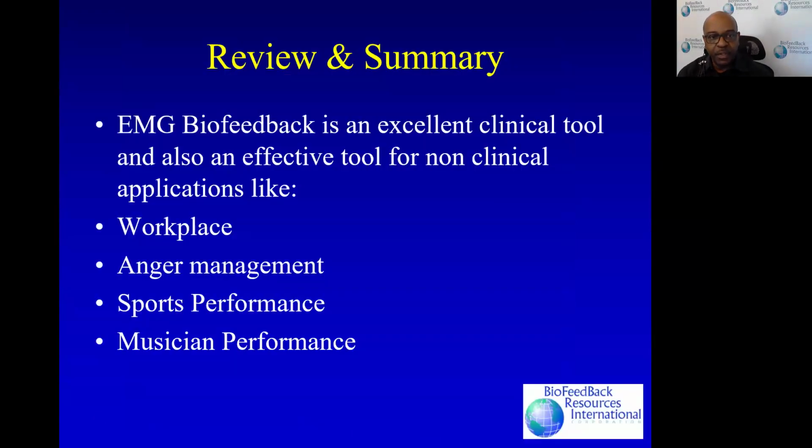And then just to review, EMG biofeedback is a great tool that you can use clinically, and you can also use it for non-clinical applications. We talked about the workplace, thinking about at the computer, anger management, sports performance. With sports, you can look at how a person is using their muscles. Are they contracting the muscles that they should be contracting? Are they keeping the other muscles that don't need to be contracted relaxed during times they don't need to be contracted? That can help a person with different types of sports, whether it's baseball or golf or whatever. There are going to be times that a person tensing their muscles interferes with their performance, and you can use it to train them on that.